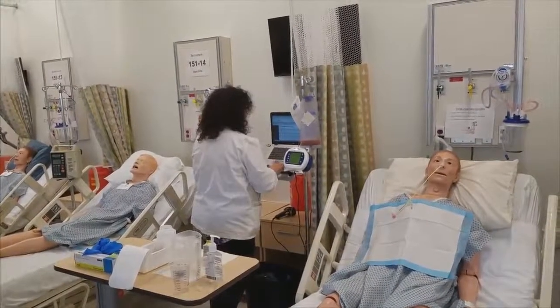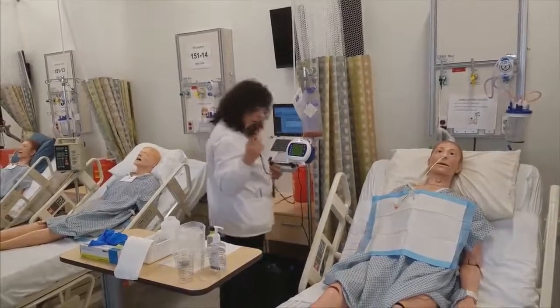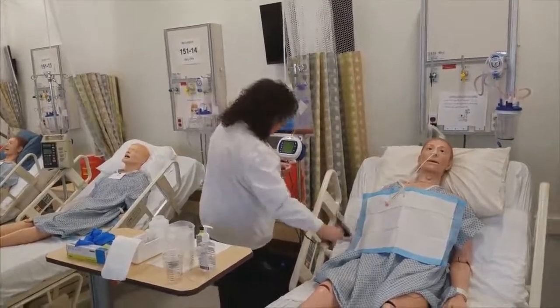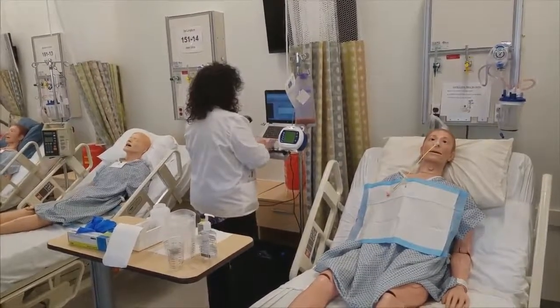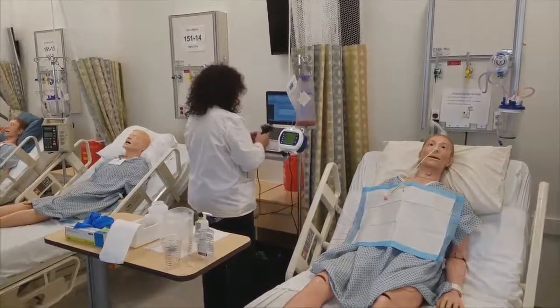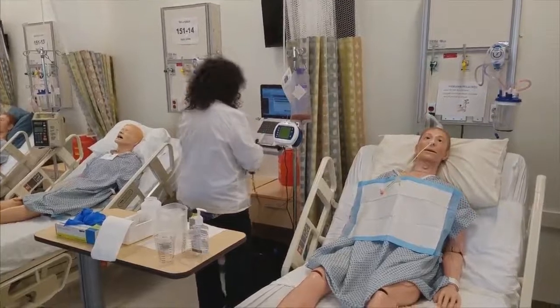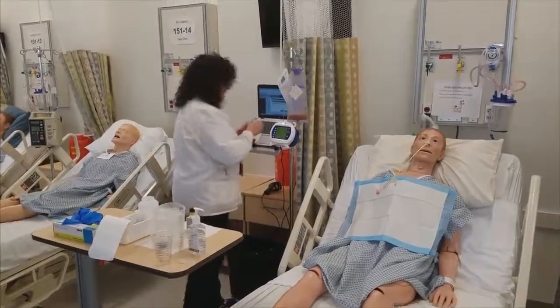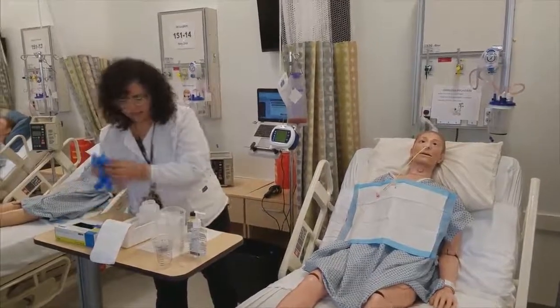I am going to hit administer. At this point, I would go ahead and scan the patient's barcode, his wristband, and then scan my first med. Okay, so check 3 and then scan it in, and then I'm going to go ahead and prep this.